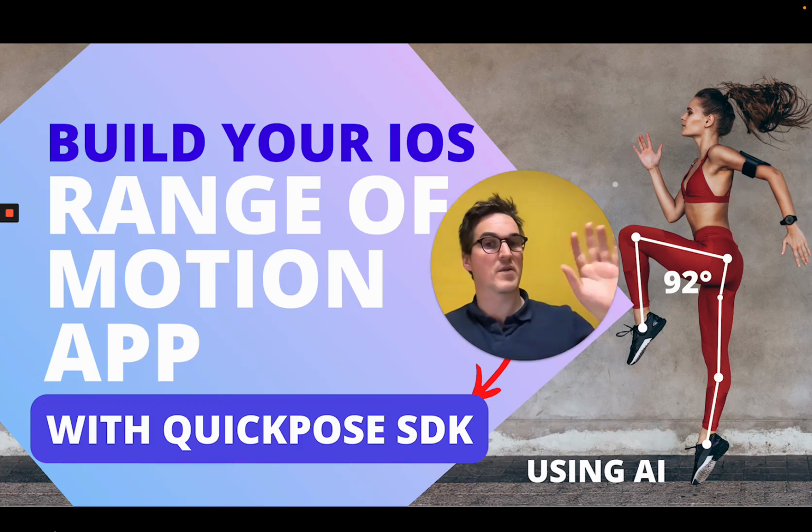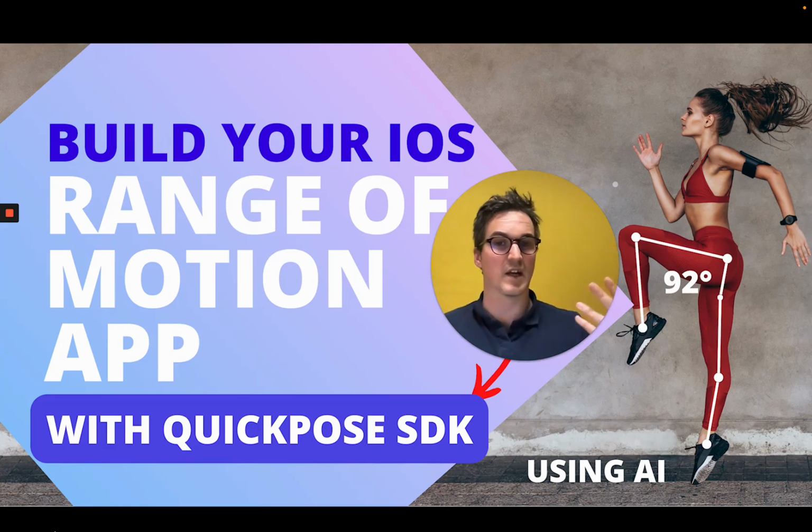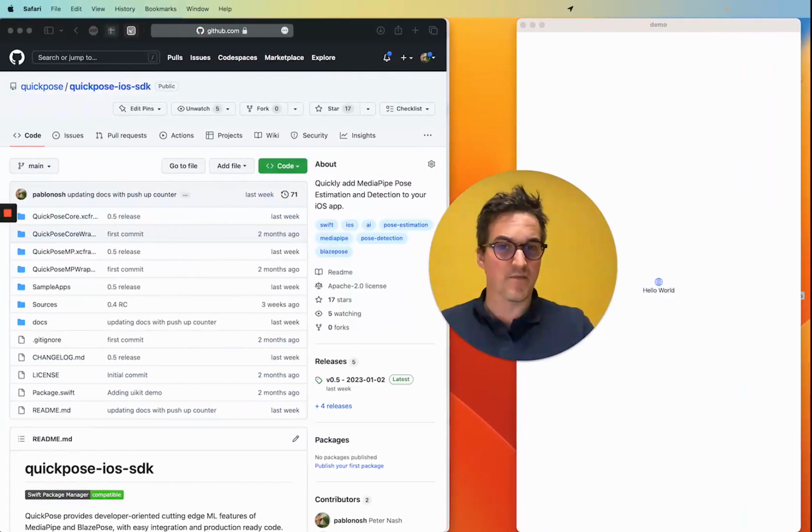the right. You've got a picture of a lady and we've drawn some dots on her legs to highlight her legs, and then we've measured the angle between them. This is more of an example, but as we develop the app today, you'll be seeing this made in code and in real time. So let's crack on.